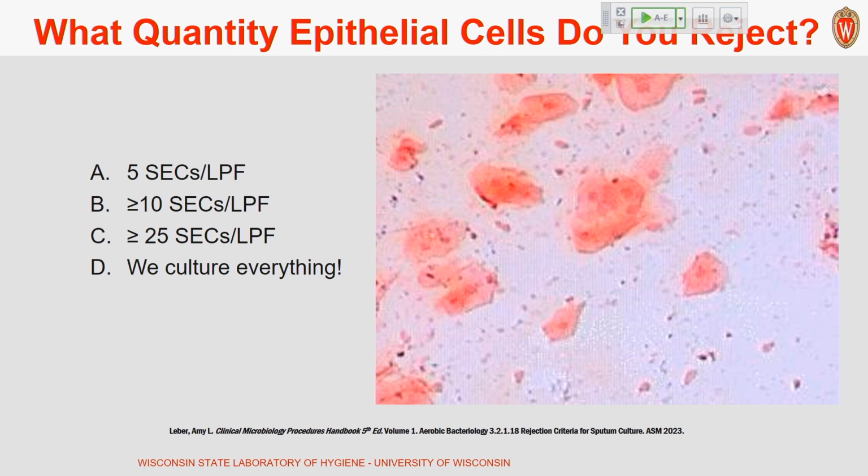I know historically that has been some of the consideration. If you do see a preponderance of PMNs, maybe associated with a predominant morphotype, that would potentially proceed, but I don't recall seeing that in the current updated guidelines.